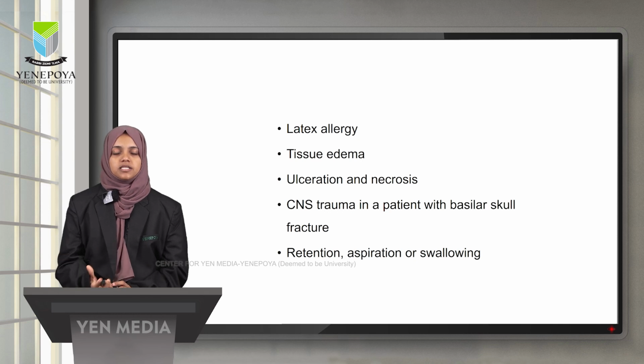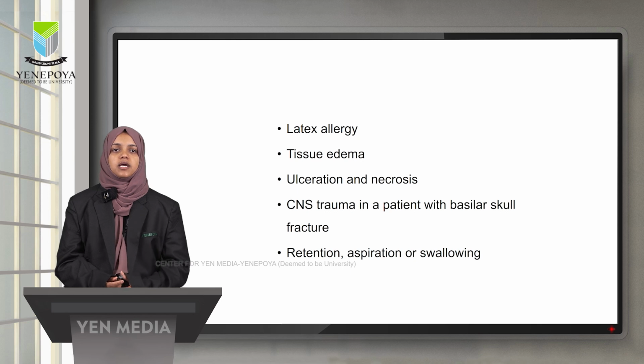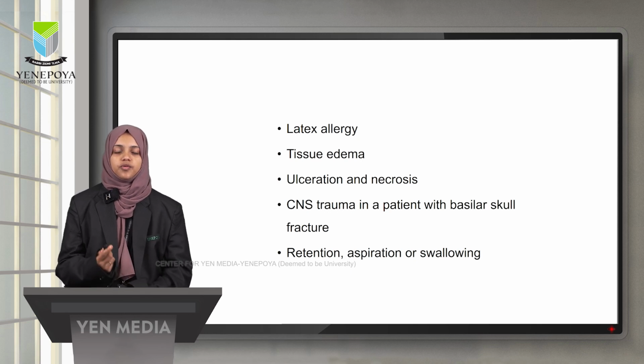If the patient has a basilar skull fracture, there is a high chance of trauma to the central nervous system when the airway is inserted. And there is another chance of retention, aspiration or swallowing of the airway. So all these chances should be taken care of.